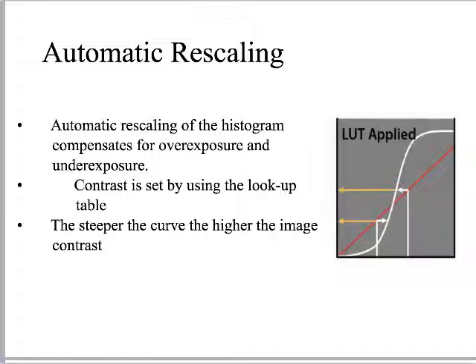This grayscale, this rescaling process, is embedded in the lookup table, right? So not only will the image that results look different, it might be a Joker versus the wedding picture type thing. If you can imagine, the contrast will be different as well. It's embedded in the lookup table. But in general, registries kind of partition this out, and they ask you questions just about the H&D curve as it relates to contrast. Are there questions about it? I've tried to make this as simple as possible.